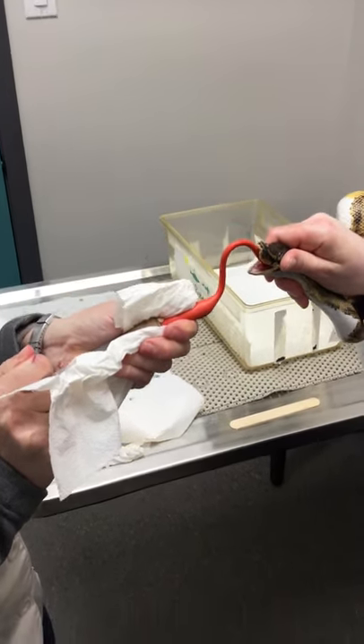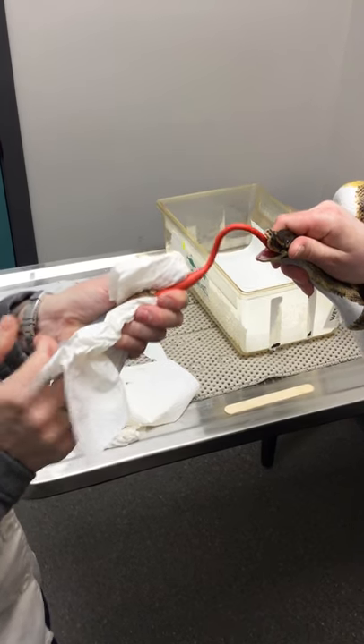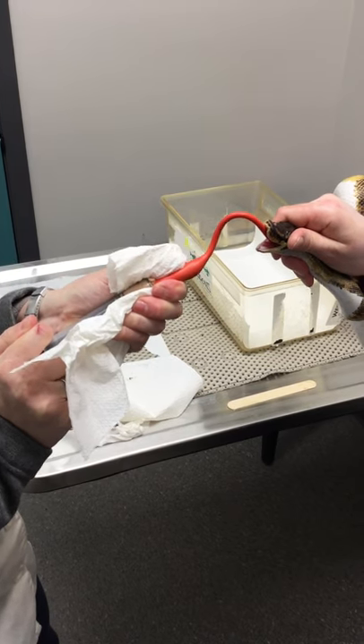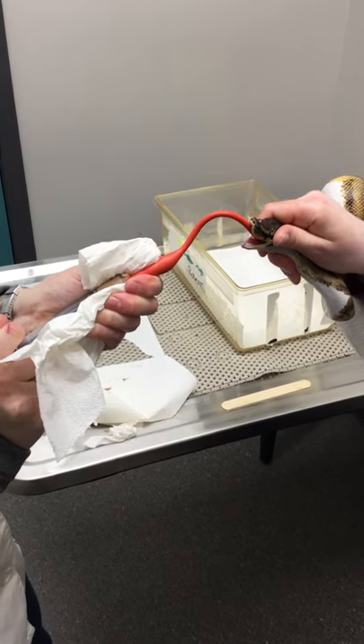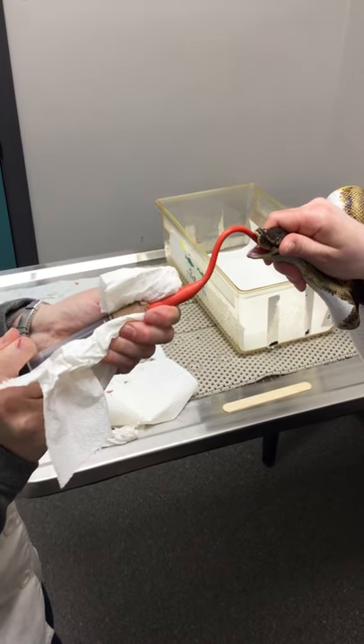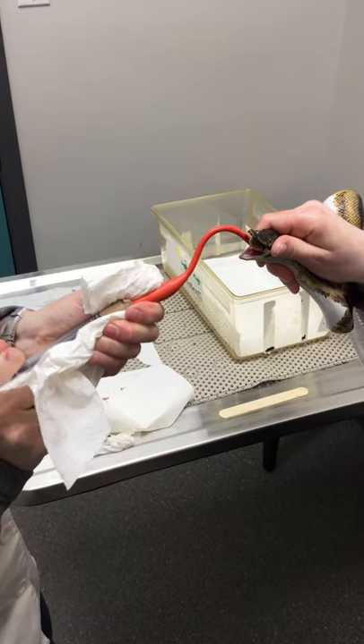It's going to take quite a bit of force, and you'll see the tube bulging to get the food through because it's thick. I don't like to dilute it out too much, because then you're just diluting out the energy and the food. If you find it's really hard to push, you could mix the food with a little bit of water.